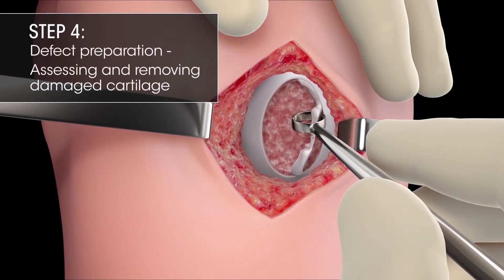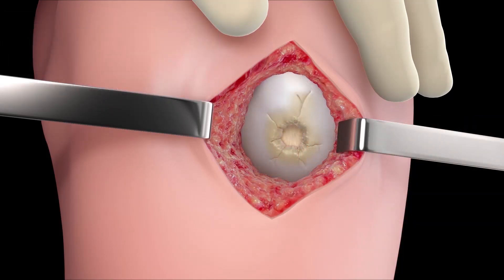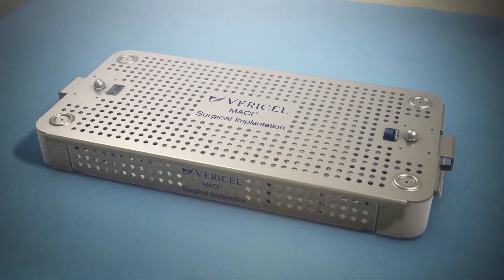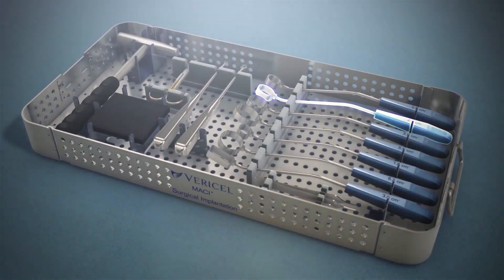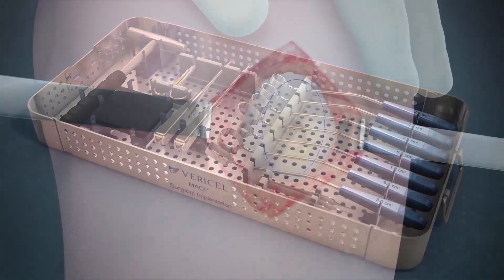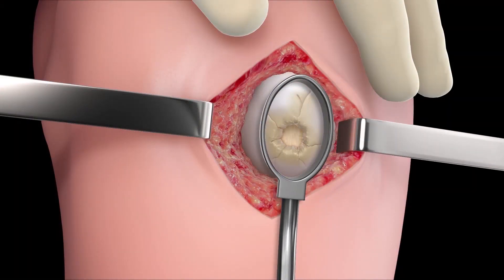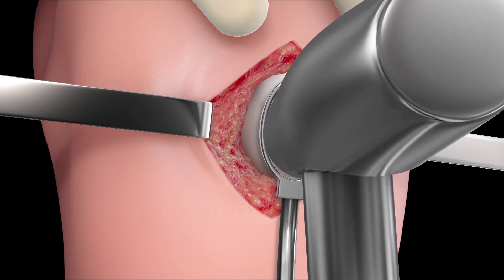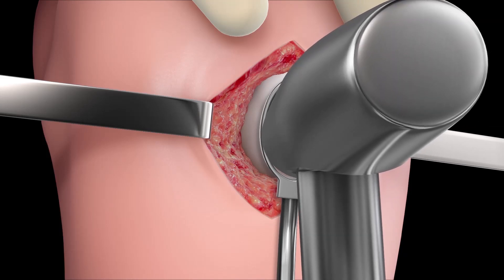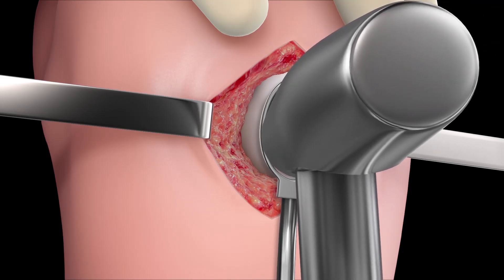Step 4: Defect Preparation — Assessing and Removing Damaged Cartilage. First, assess the cartilage defect for all diseased, damaged, delaminated, or thinning cartilage. Then determine the appropriate size cutting template from the provided MACI Surgical Implantation Kit. Align the selected instrument to the cartilage defect, outlining the area of the defect. Then, using the mallet, gently tap the instrument down through the cartilage to the subchondral bone. Take care not to penetrate the subchondral plate.